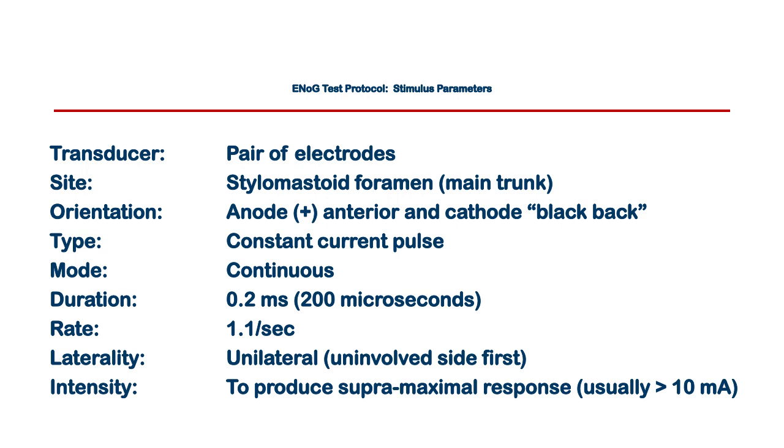Always stimulate just one side, and you try to get up to the highest level of current you need to present, the highest level of current to get the biggest response that's not going to get any bigger. And that's called supermaximal. And I'll show you a diagram.